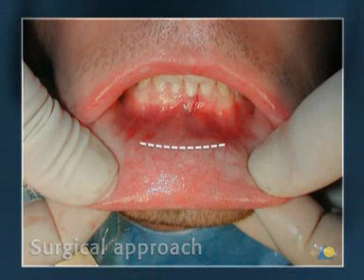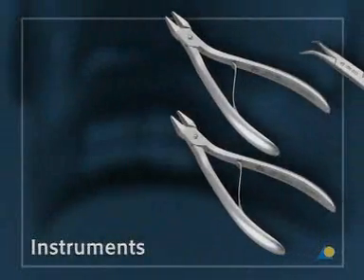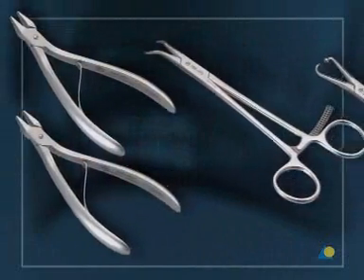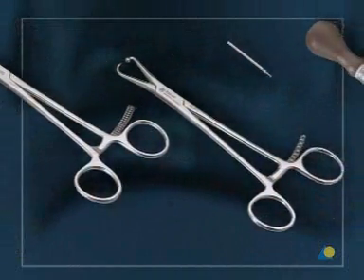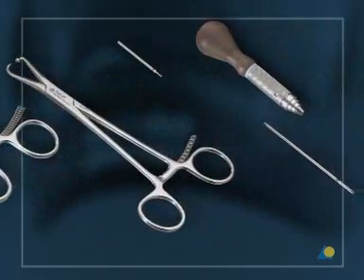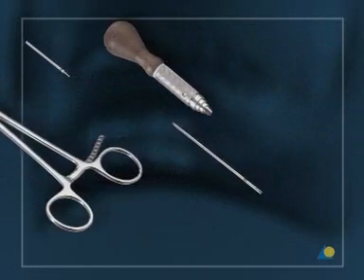The standard approach for fractures of the symphysial region is intraoral. The instruments needed are two bending pliers, the reduction forceps, the holding forceps with ball tip, the 1.5 mm drill bit with 6 mm stop, and the 1.5 2.0 cruciform screwdriver shaft with handle.